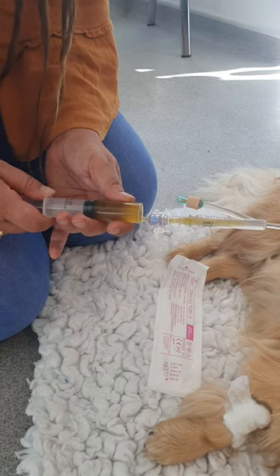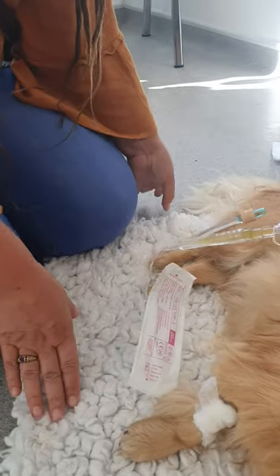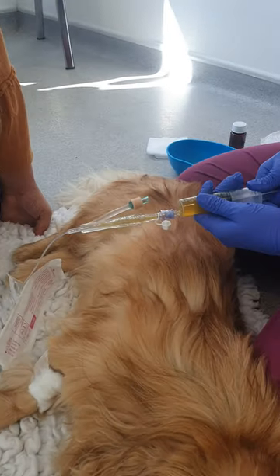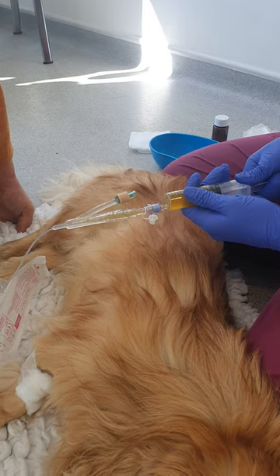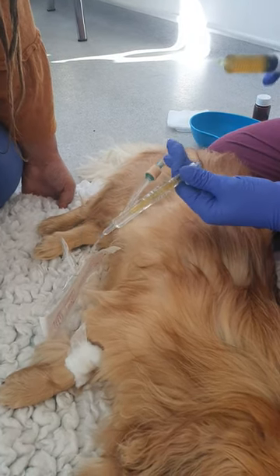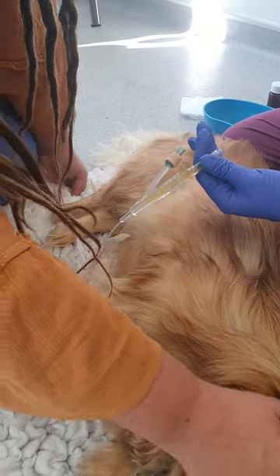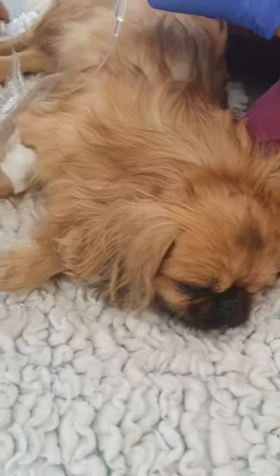Yeah, I can feel the resistance now. Lovely. At least have a little check. Yeah, once it gets like that, then it stops. That's not too much wee, but to be honest, we won't have produced that much from the last time that we haven't taken it.